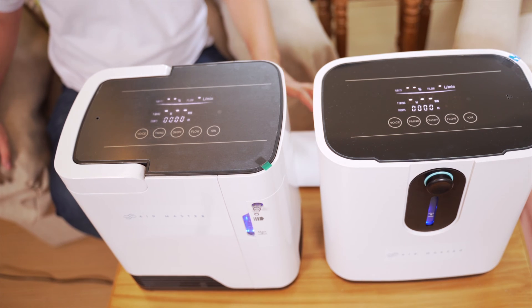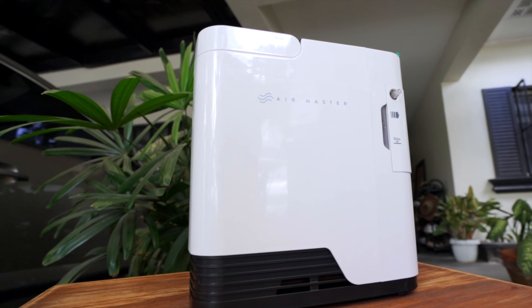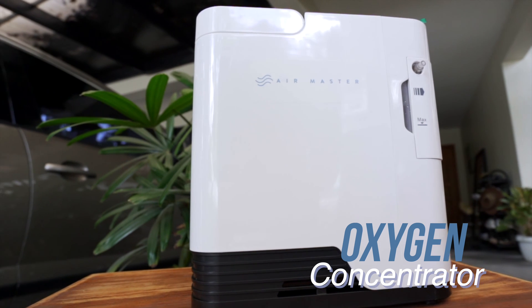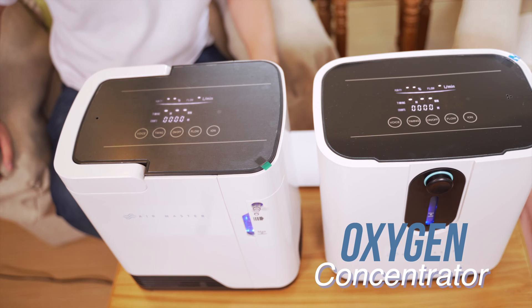Good day! We're here to demonstrate and do an instructional video for Air Master's oxygen concentrator. We're also joined with Air Master's family doctor. Good morning, Doc. Good morning!